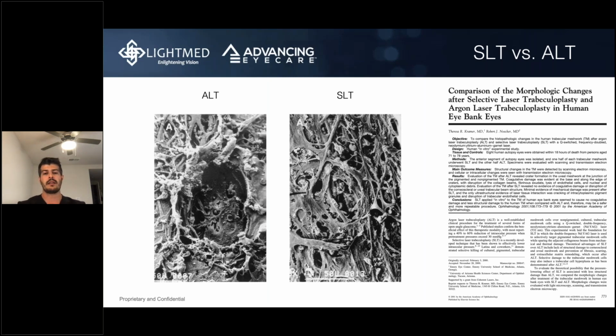I don't have to worry about cleaning the instruments, and especially with COVID, you worry about risk of transmission, especially if you have few patients back to back. So we use single-use gonio lenses for SLT, and they're very cheap. You just open the package, put the gonio gel on it, and you're done, and then you toss it to the trash. So that's my preference.